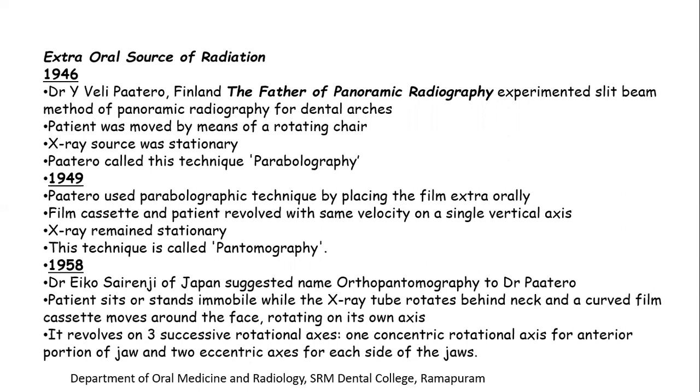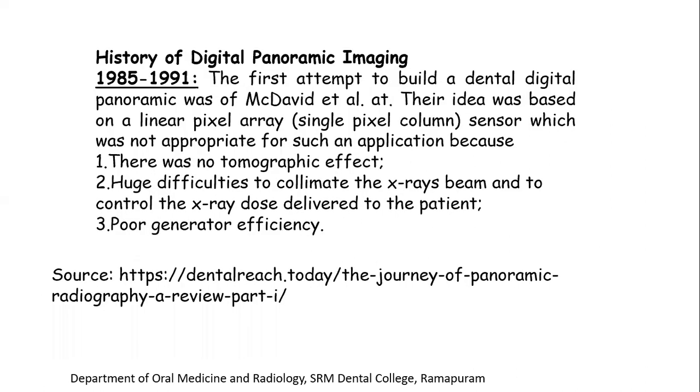In 1958, Dr. Eiko Sairenji of Japan suggested the name orthopantomography to Dr. Paatero. The patient either sits or stands immobile while the X-ray tube rotates behind the neck and a curved film cassette moves around the face, rotating on its own axis. It revolves on three successive rotational axes: one concentric rotational axis for the anterior portion of the jaw and two eccentric axes for each side of the jaws.